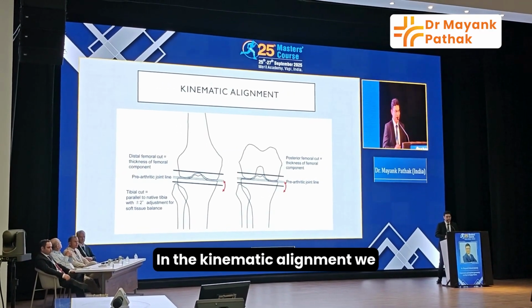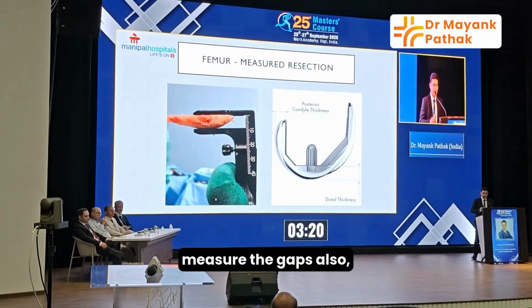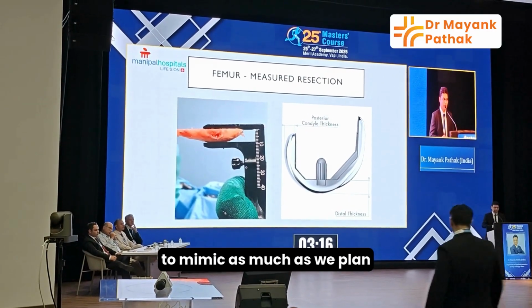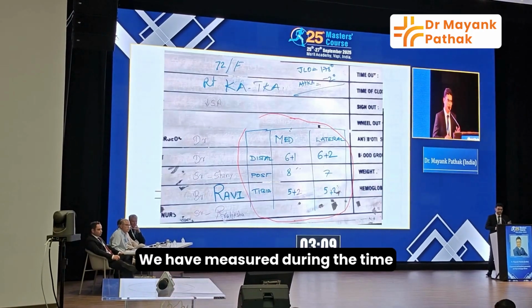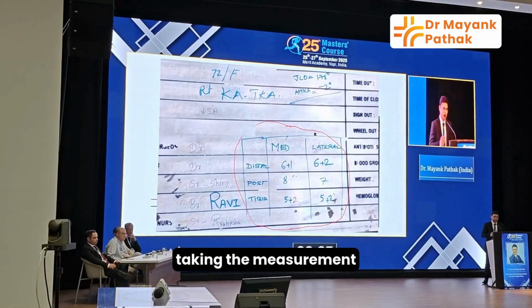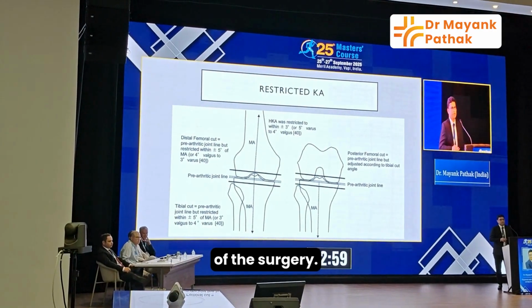In kinematic alignment, we measure the gaps also. We measure the cut, and we try to mimic as much as we plan, considering the loss from the saw. We have measured during the time of the surgery also. We keep on taking the measurement, and then we perform the kinematic alignment of the surgery.